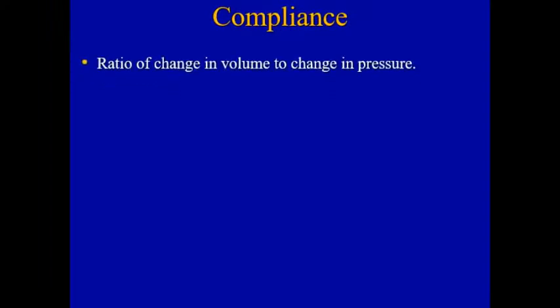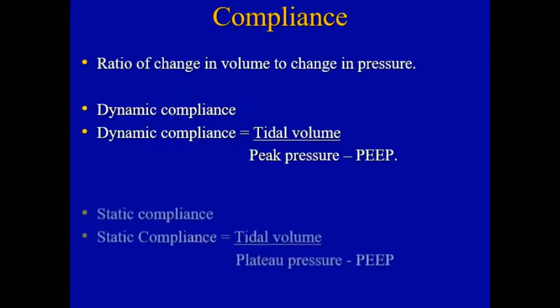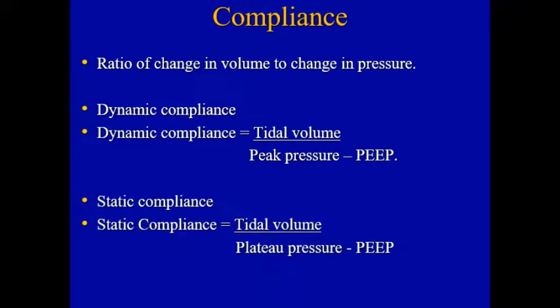So what is compliance? Compliance is defined as the change in volume per unit change in pressure. We have two compliances, one is dynamic compliance and another is static compliance. Dynamic compliance takes into account the peak airway pressure, and static compliance takes into account the plateau pressure. So dynamic compliance is equal to tidal volume divided by peak pressure minus PEEP, and static compliance is equal to tidal volume divided by plateau pressure minus PEEP.